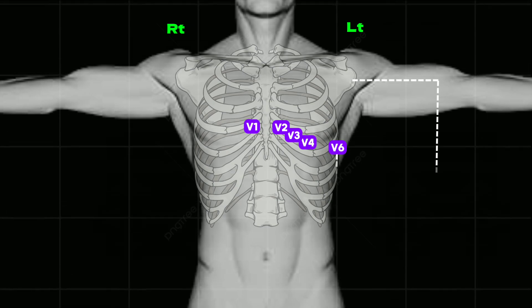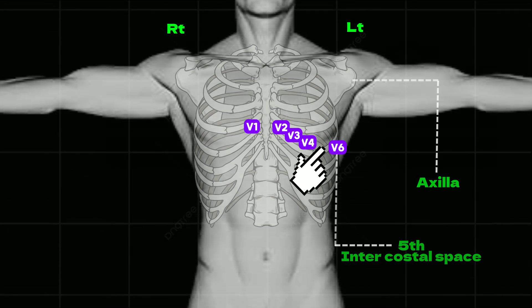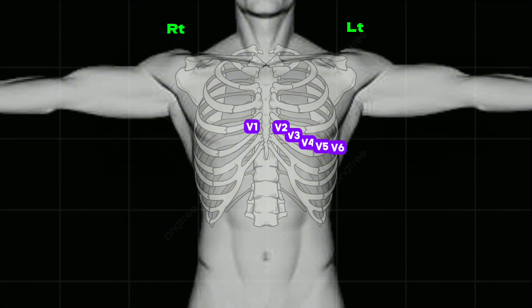V6 is attached at the mid-axillary line at the 5th intercostal space. And V5 is attached between V4 and V6.